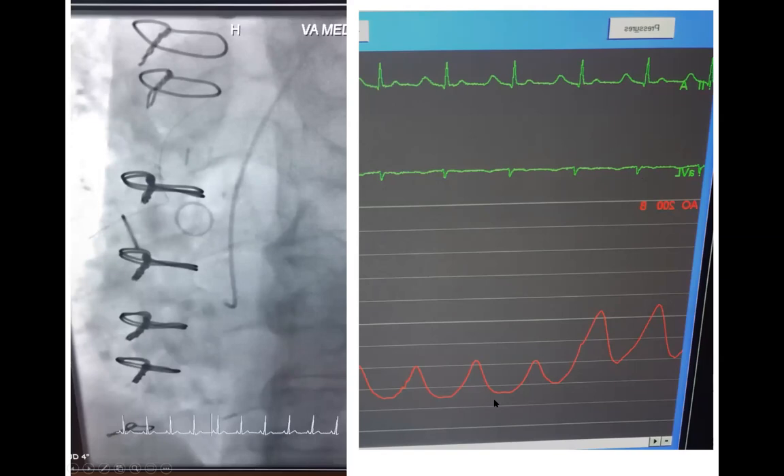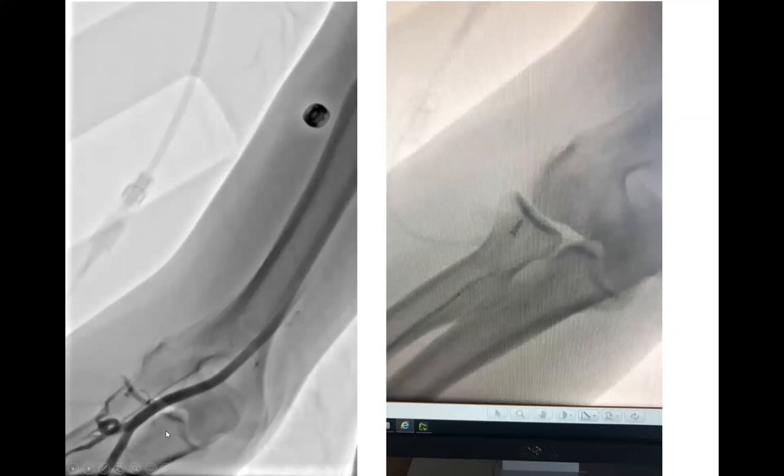This is another case from this week — a patient going right radial. We advanced the wire blindly and felt resistance in the mid-arm. We switched to a woolly wire and still couldn't advance. At that point, do not use a glide wire in the forearm — if you use a glide wire, it will slip anywhere and you'll get compartment syndrome and perforation.